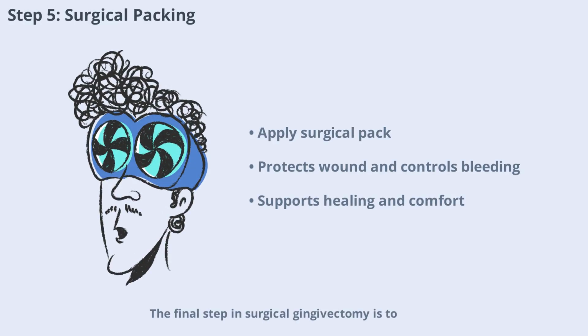The final step in surgical gingivectomy is to cover the treated area with a periodontal surgical pack.